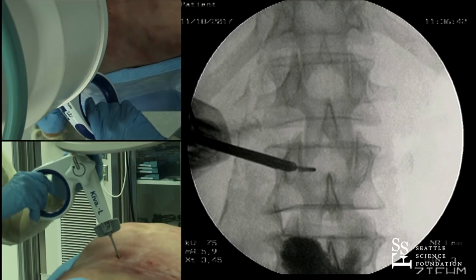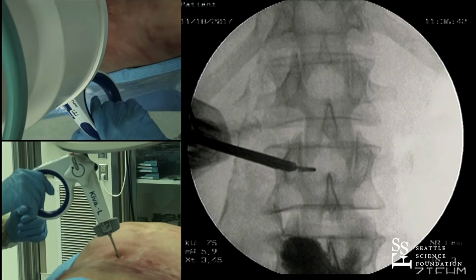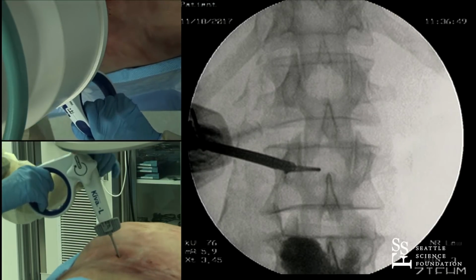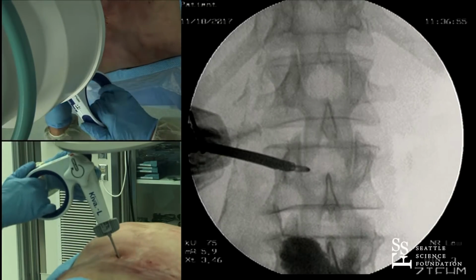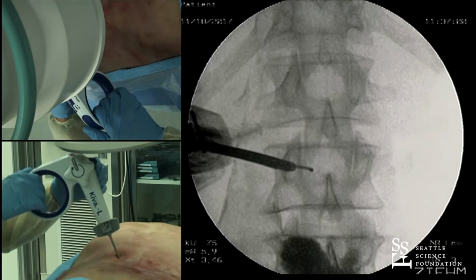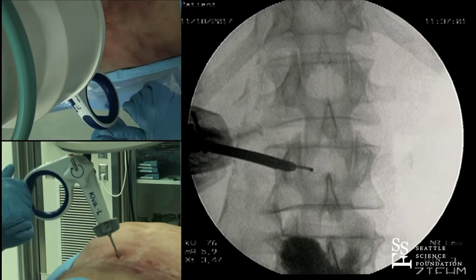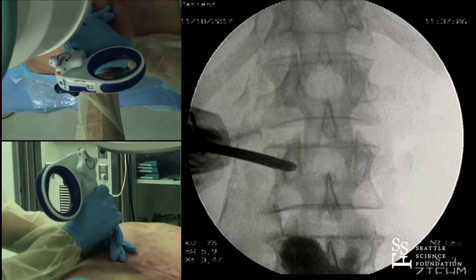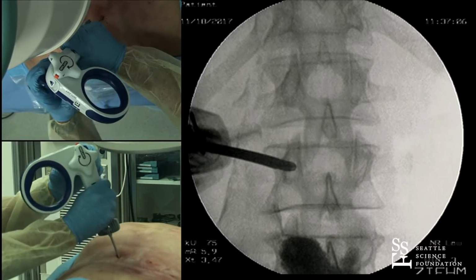So we're getting a little ipsilateral. At this point in time, I may want to change and go a little bit more toward the contralateral side. So I'm going to pull this back in. It looks like we're in pretty good position, but this is a big vertebral body, and I'd rather get this more toward the center of the vertebral body. So I'm going to pause right here, and I'm going to put this back in, undeploy this, and take it out.